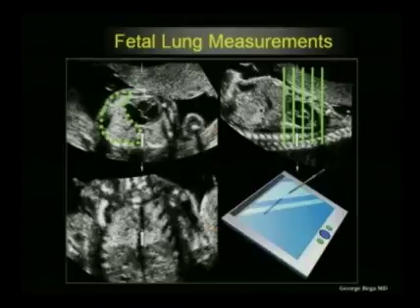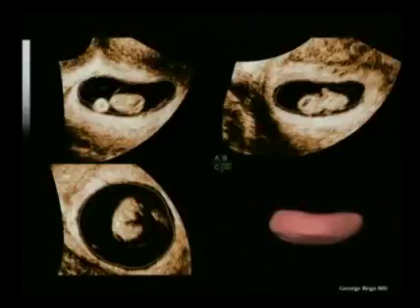Of course, lung volumes can be quantified. The problem here is that the lung volume is not necessarily connected to the lung function. We have assumed that to be the case before, but nobody as of now has been able to prove in the literature that we have a direct correlation between lung volumes and lung maturity. So much more work needs to be done.